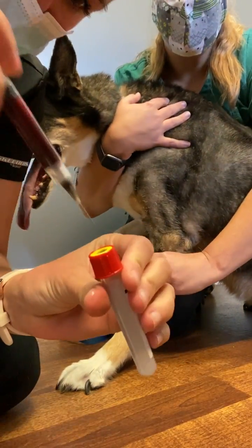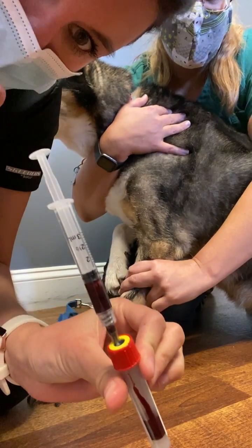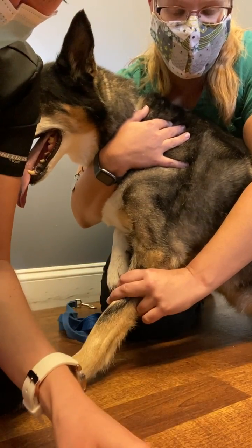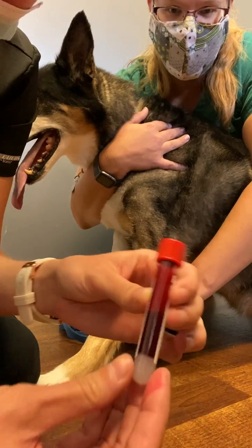Here's my tube and I'm going to let the blood just kind of go in there by itself. And that is plenty of sample — as you can see, it's at least a milliliter.